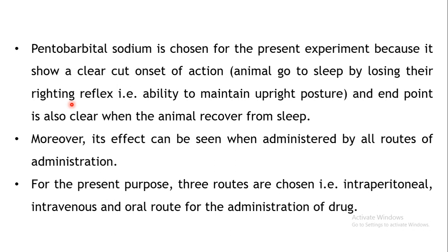When the animal is awake, it will correct its posture, maintain its upright position, and quickly change its position. But as a result of the effect of this drug, the animal loses its righting reflex. Even if you place it on its back, it will not regain its upright posture.